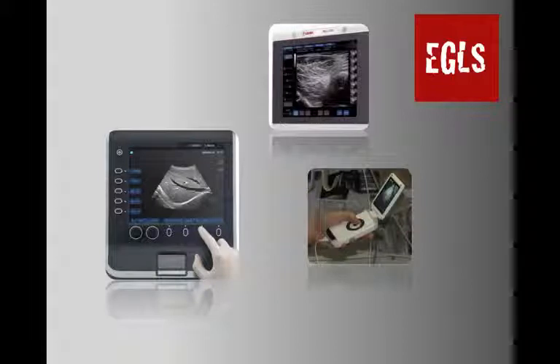Now, ultrasound shouldn't change our practice completely, except maybe when we unexpectedly find a tamponade, but it will help us have a narrower differential, a better working diagnosis, and get there faster. In addition to enhancing the quality of our evaluation, it will help us feel more comfortable as clinicians. For every patient in shock we see, we can get to a point where we're getting out of our comfort zone. This will happen faster with older, sicker patients.